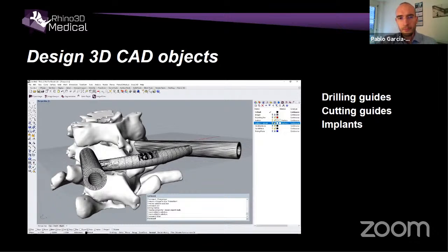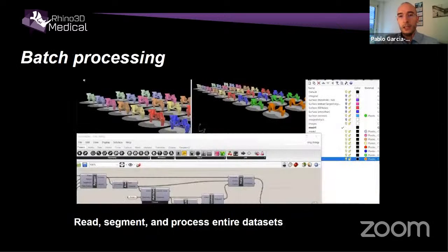For example, now we are working on creating drilling guides that can be used as patient-specific surgical guides. And we are currently also working on offering cutting guides for osteotomies. And in the roadmap, there are also implants around there.